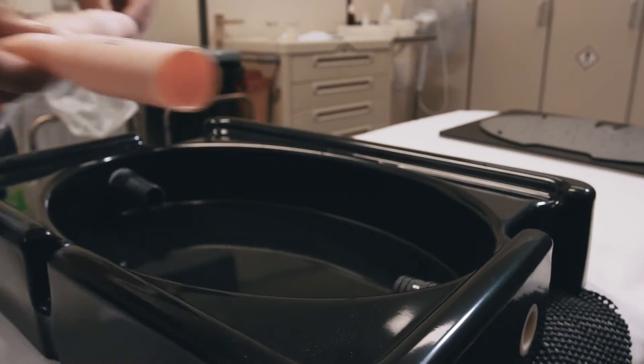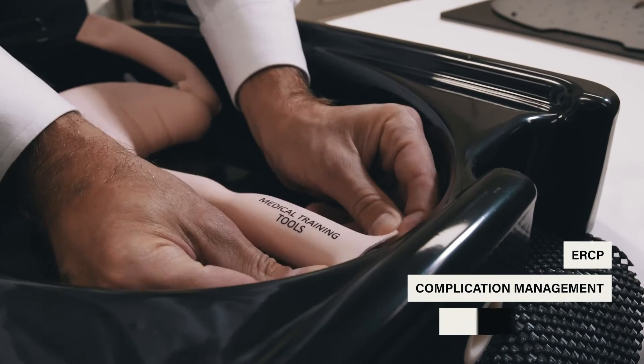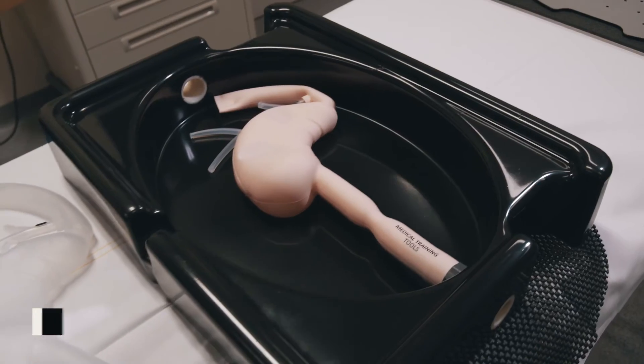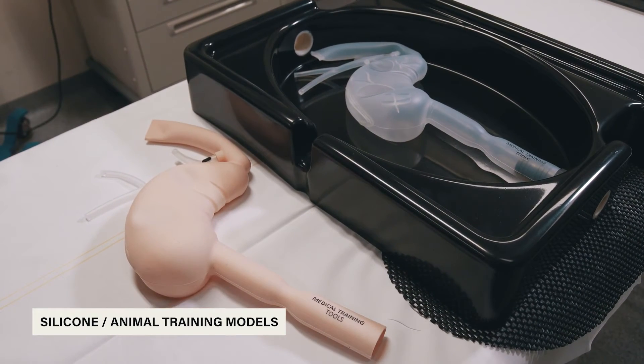The TD Box can be used for various purposes, including trainings in ERCP, complication management, and foreign body removal. The training platform can be used with either silicone or animal training models.